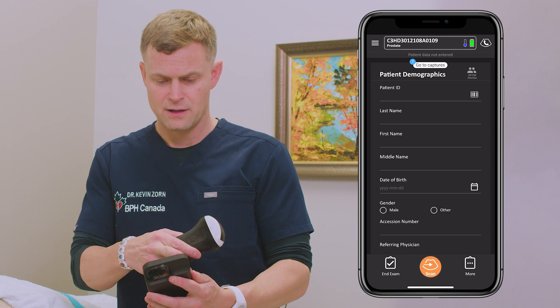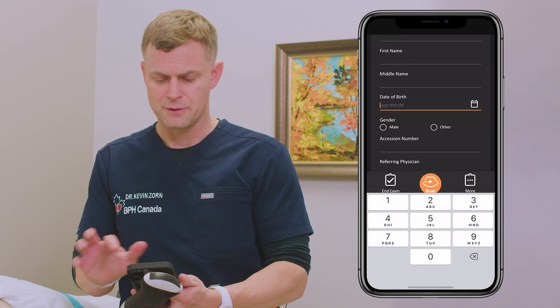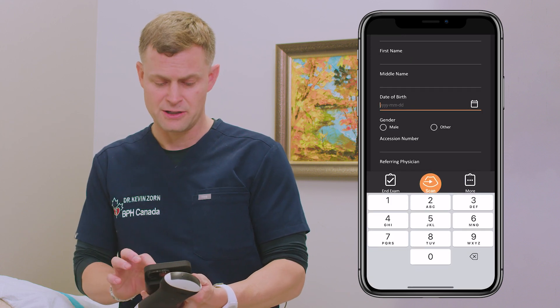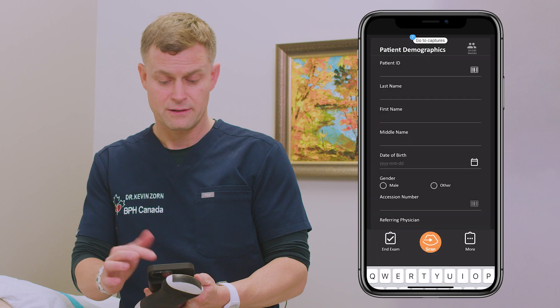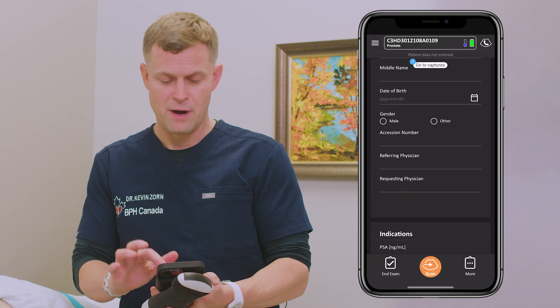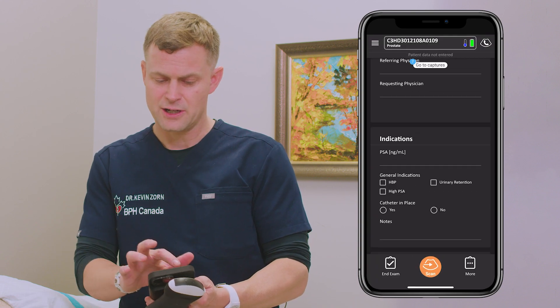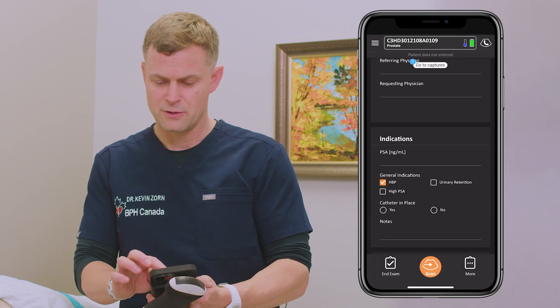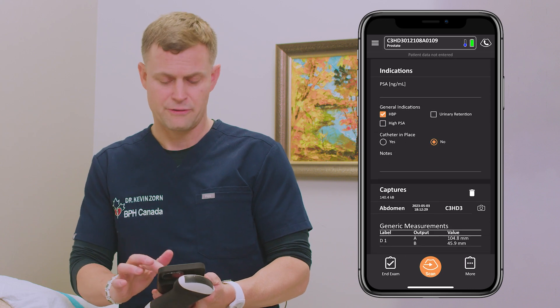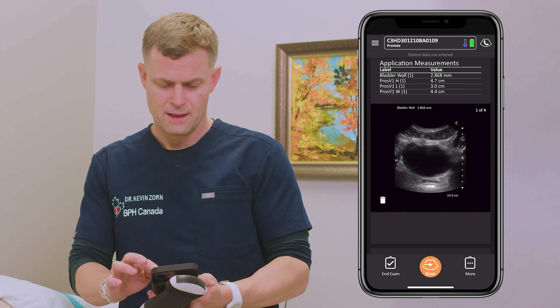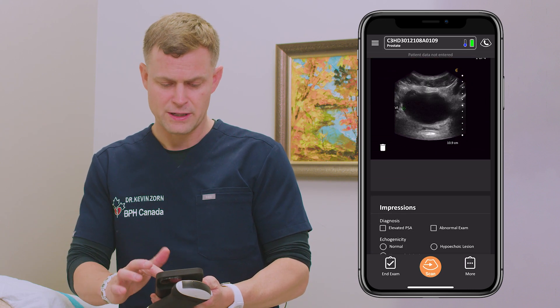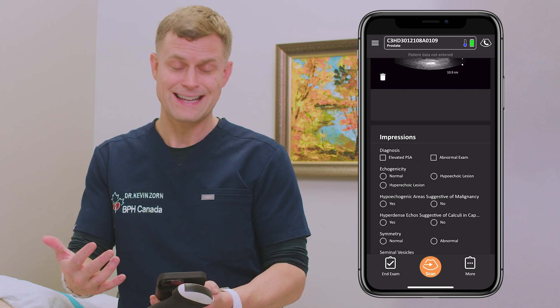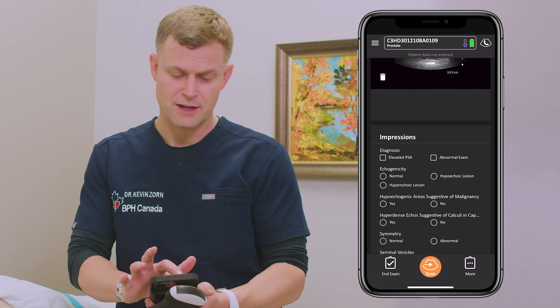This completes the ultrasound findings, and I'm going to move toward a final summary report. I'll be able to enter in the patient's information and generate, with a click of a button, some of the findings. The indication here was BPH, there was no catheter in place, and who the referring physician was. Simply scrolling down, you can see the impressions pre-modeled into the app for the prostate.